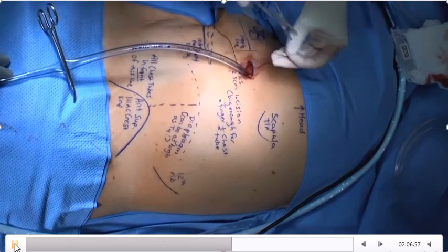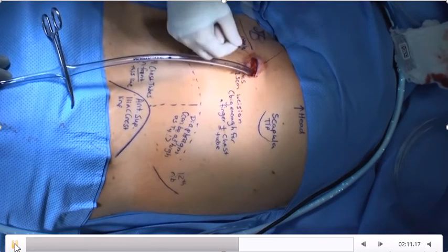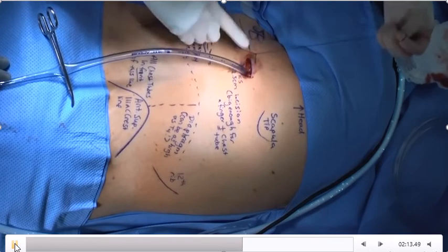After he takes the bites of the suture, he then uses his hand to make multiple ties and knots around the tube.